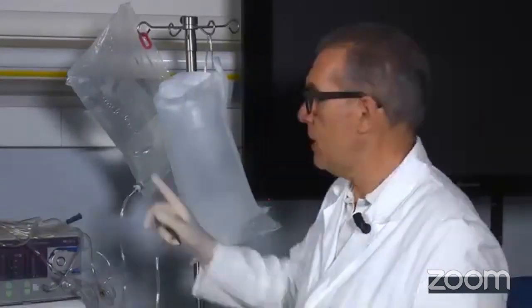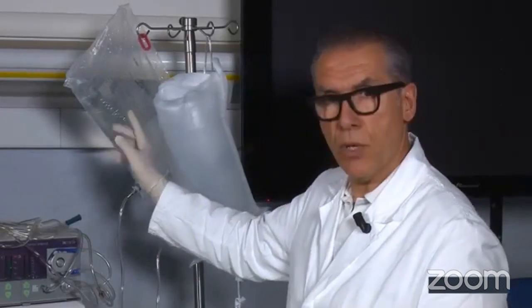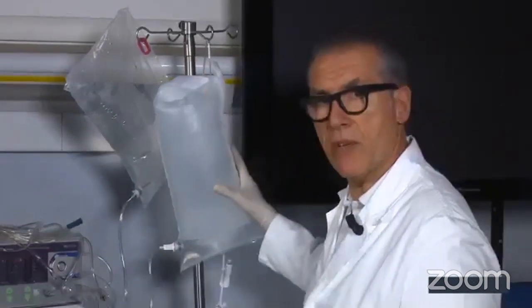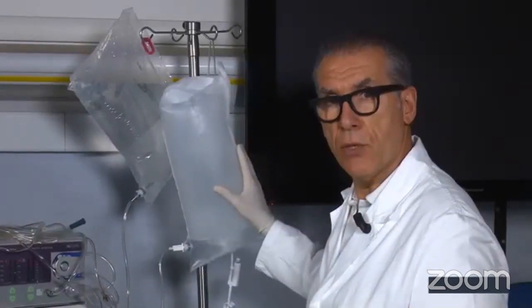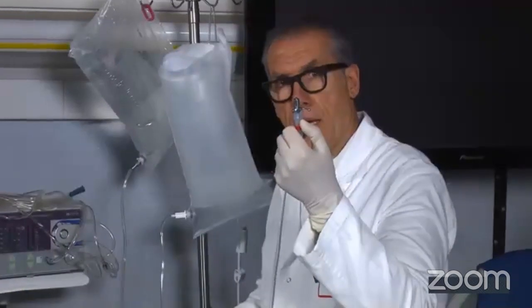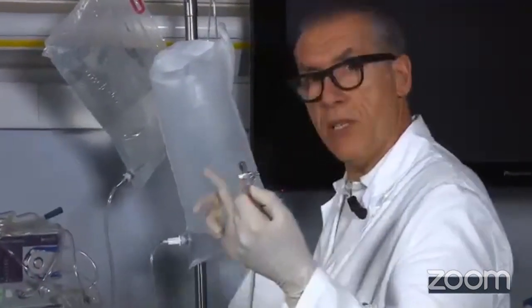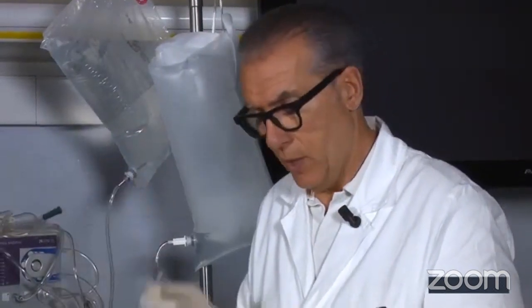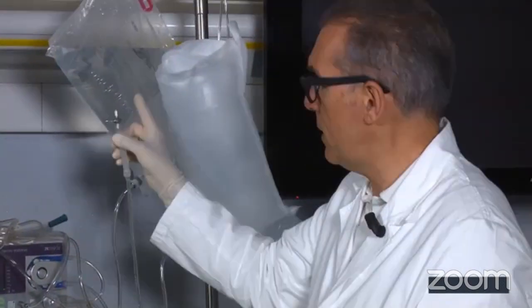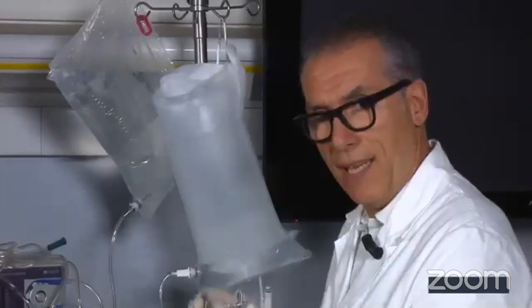So we have two sacs, one with the gravity pressure, still 5 liters, and the other one inside the compressive cuff, of 5 liters too. The red one is the one connected to the compressive cuff. The white one is the one acting on the gravity pressure. So look what's happened, same amount of liquid. This is only with the gravity pressure. This one with the extra force.